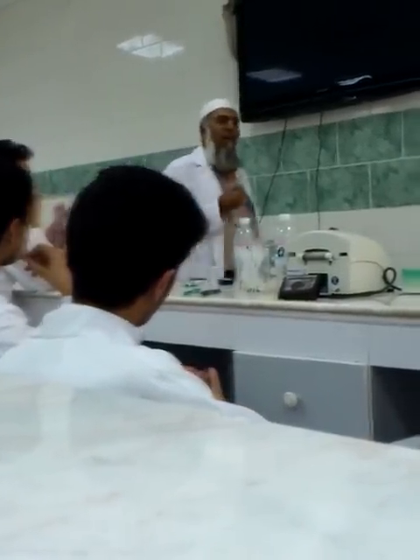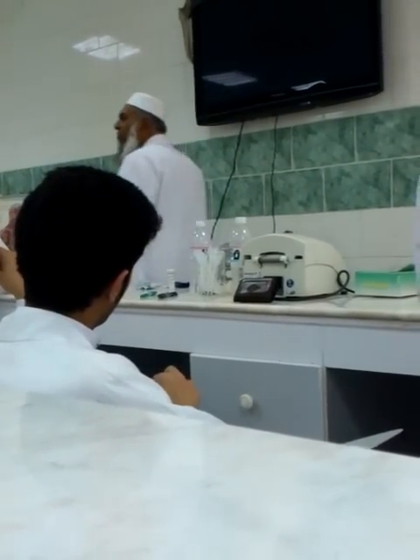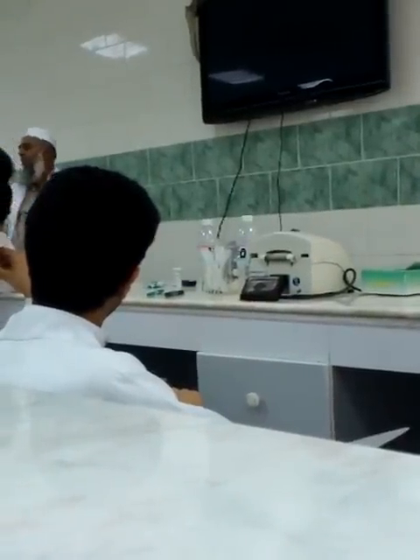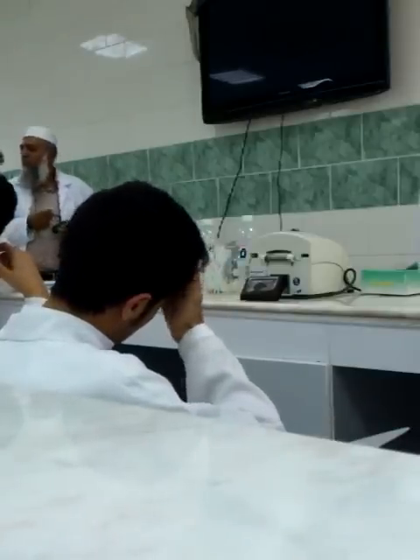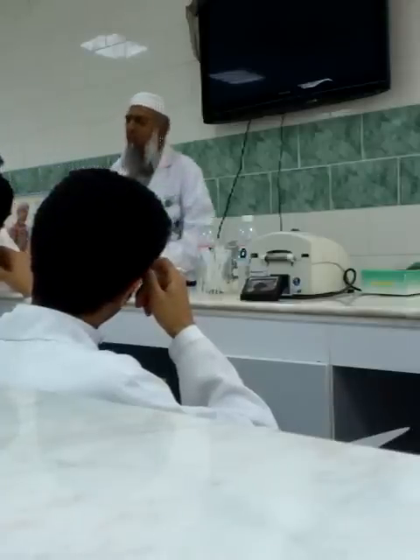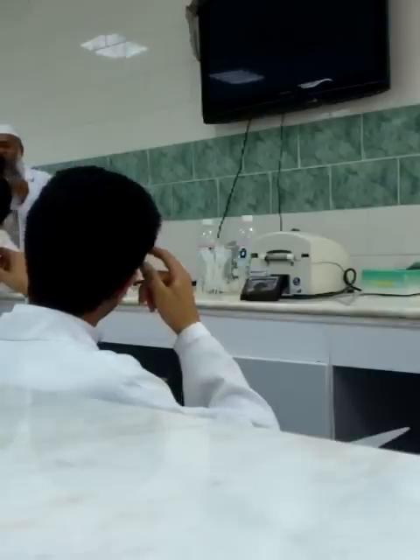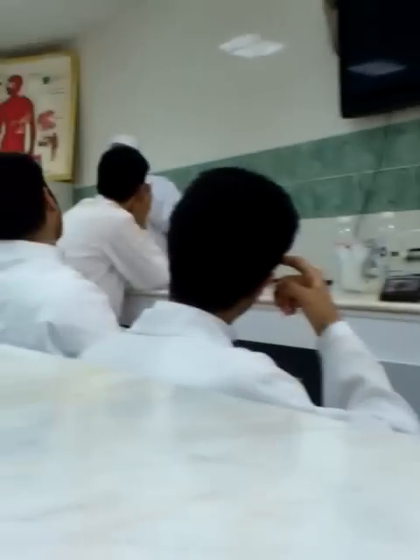Now what is the advantage? Suppose that one day your battery is out of order or something is wrong with your glucometer and you cannot check your glucose level. But in order to take insulin, it is a must. So what you can do, just take a drop of blood, put it on the colored area as usual.